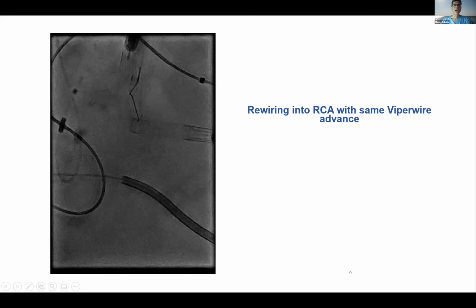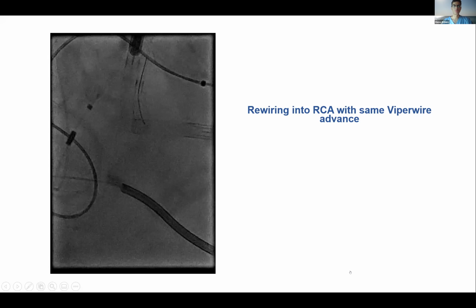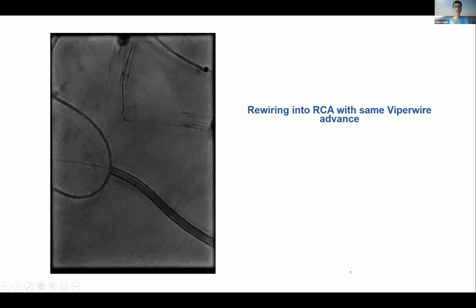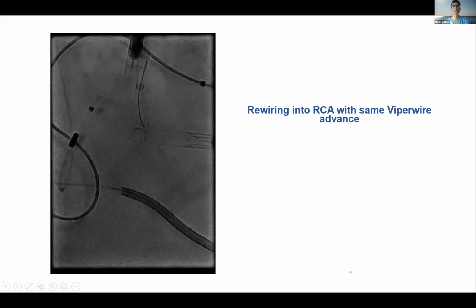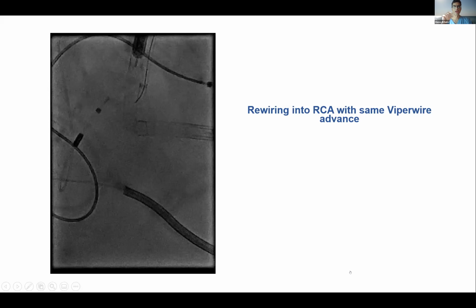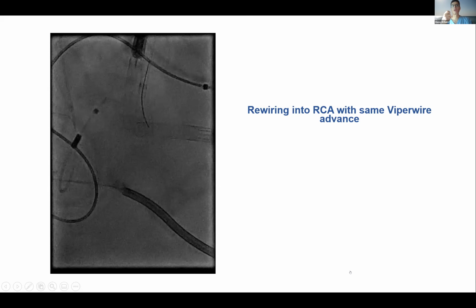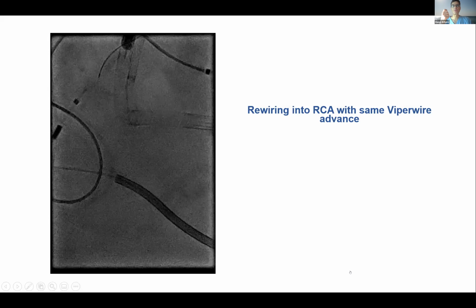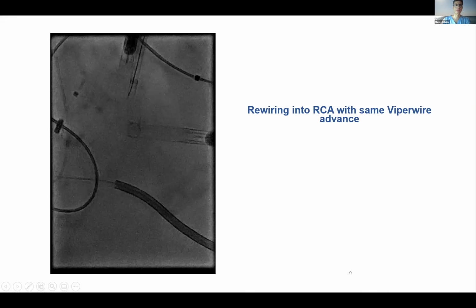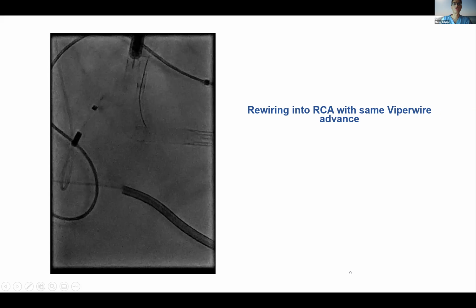Yeah, so we've done a few cases in which you use a microcatheter. We use FineCross mainly into the side branch wire. The interesting thing is that in one case we poked a hole in the microcatheter. We did atherectomy on the other wire, and that actually caused a hole in the microcatheter. Looking at it under the microscope, it was fairly good damage. So I suspect some of the material of the microcatheter got embolized further down. So yeah, I must say, I'm not very excited about this. I don't do this much anymore.